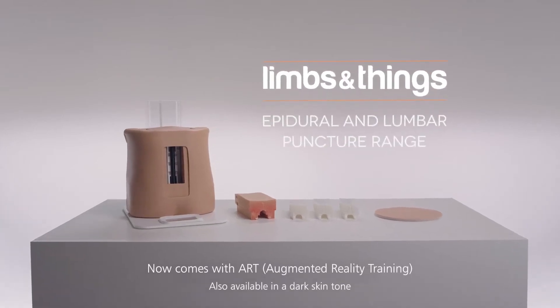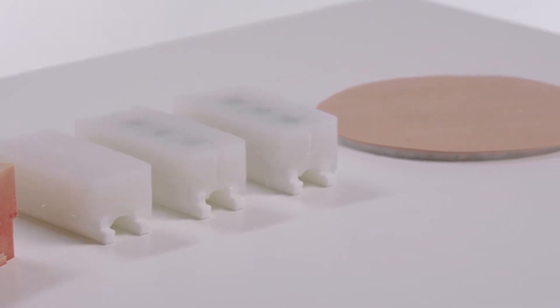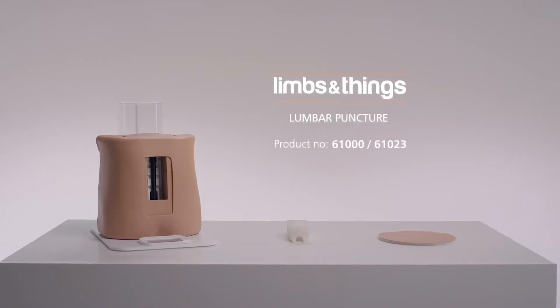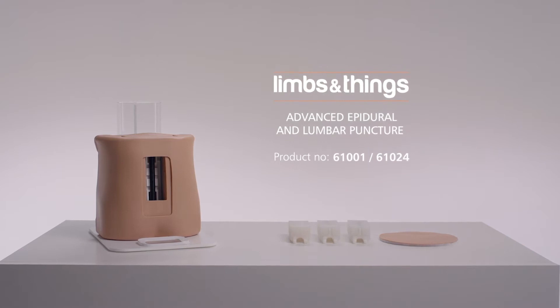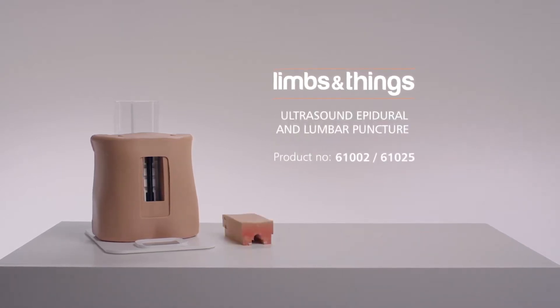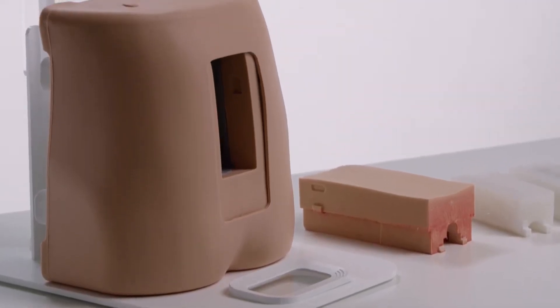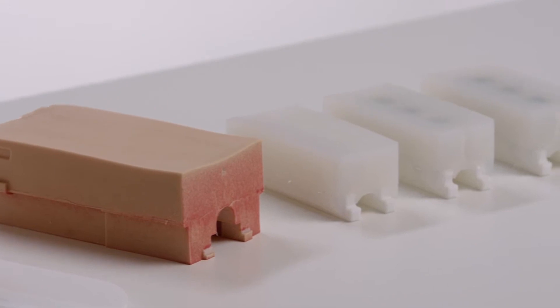This is the Limbs and Things Epidural and Lumbar Puncture Range. It features the Lumbar Puncture Model, the Advanced Epidural and Lumbar Puncture Model, and the Ultrasound Epidural and Lumbar Puncture Model. For each, there is a common base with palpable iliac crests.